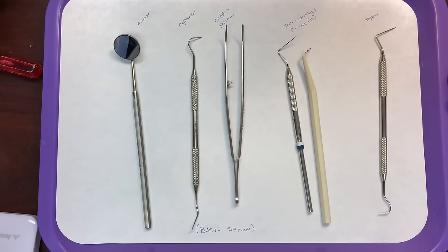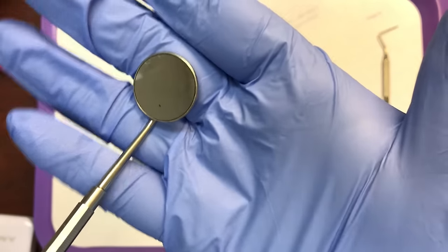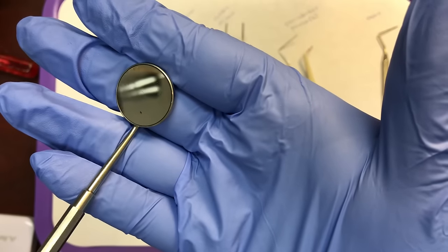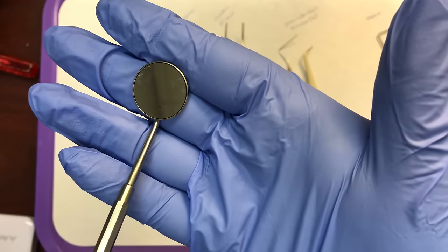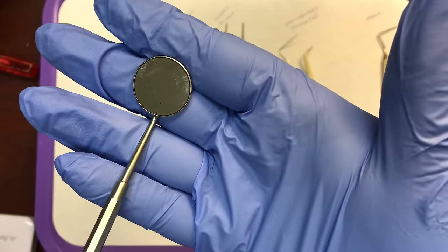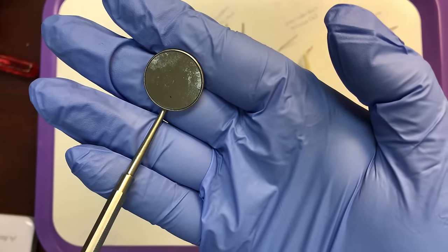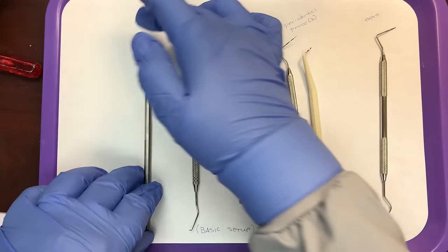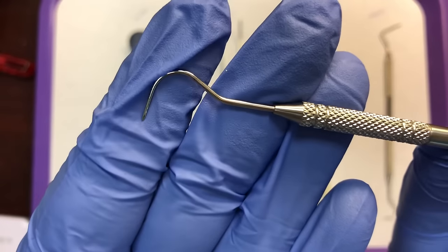The category we're working with right here is examination instruments. The first instrument is the mouth mirror, which is used intraorally and has three uses you need to memorize: it's used for indirect vision, to retract or protect soft tissue, and for illumination to help illuminate the oral cavity.